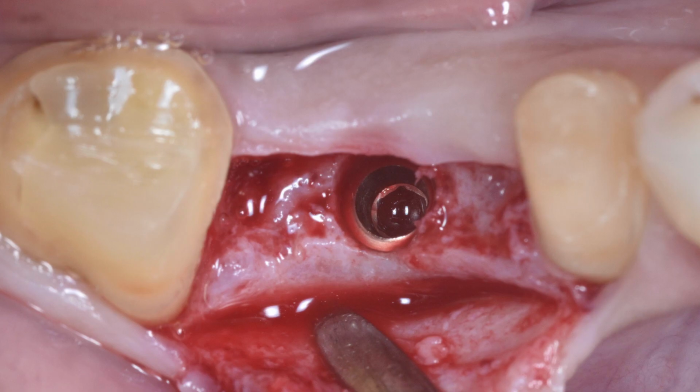If it's a soft bone, I'm going to stop in the drill for soft bone. If it's a more cortical bone, if it's a harder bone, I'm going to follow the drill. I'm going to use a second drill, which is a +5 drill in my system, that is going to just increase a little bit the diameter of that osteotomy, so that it makes it a lot easier for my implant to be drilled all the way down to the full depth of my preparation. So again, all this has to do with your implant system, and I'm sure that today all the implant systems are very similar in this regard.